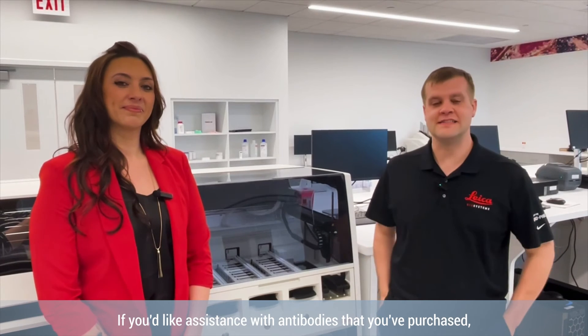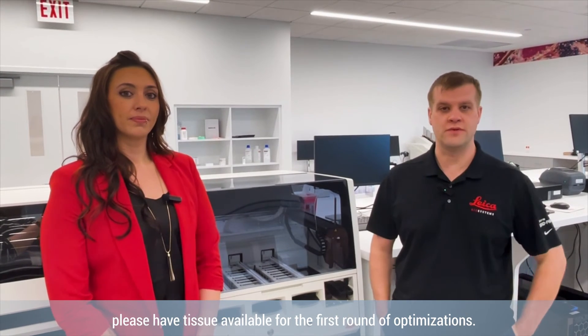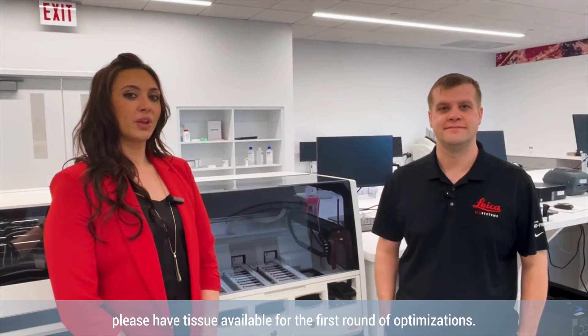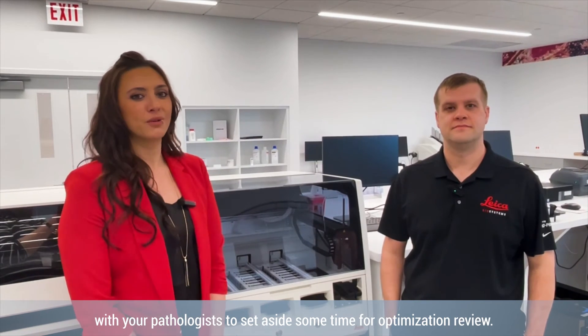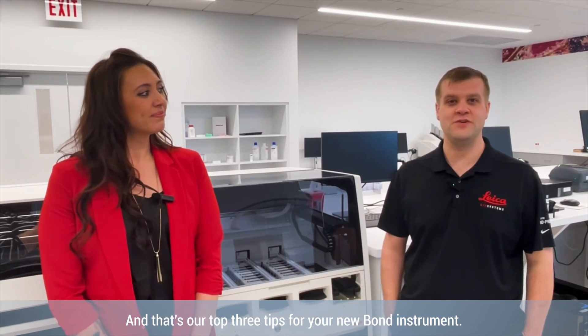Tip number three, if you'd like assistance with antibodies that you've purchased, please have tissue available for the first round of optimizations. Please confirm with your pathologist to set aside some time for optimization review. And that's our top three tips for your new Bond instrument.